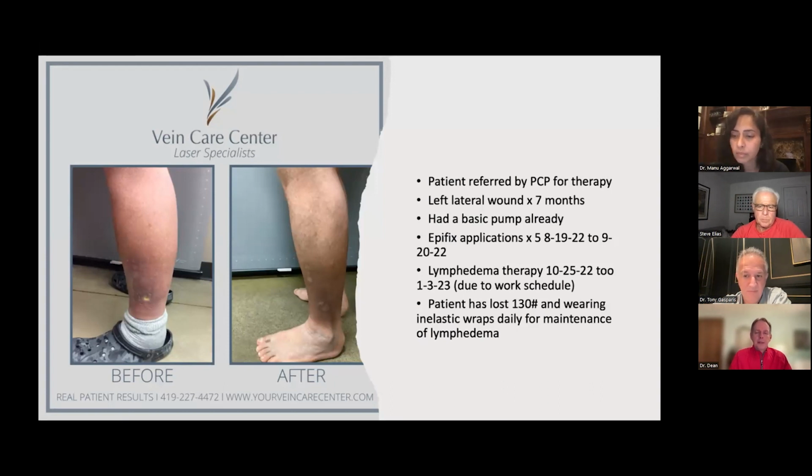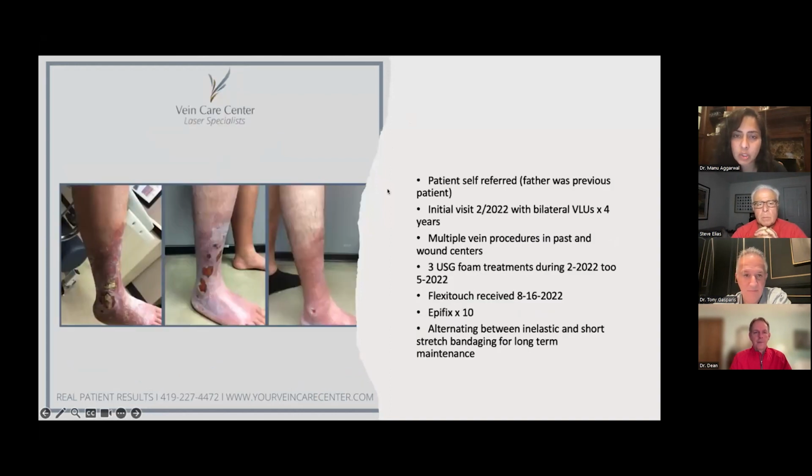Yeah, my comment is I find it extraordinary when you have these patients with BMIs in the 60s and somebody orders a complex venous mapping on them. I just kind of shake my head. But I would say 80-90% of the patients that walk in will get an evaluation of their venous system. Oh yeah, always rule out DVT, definitely.